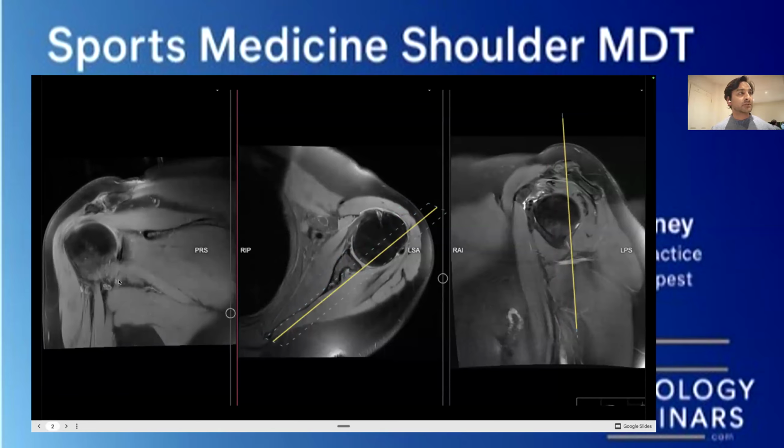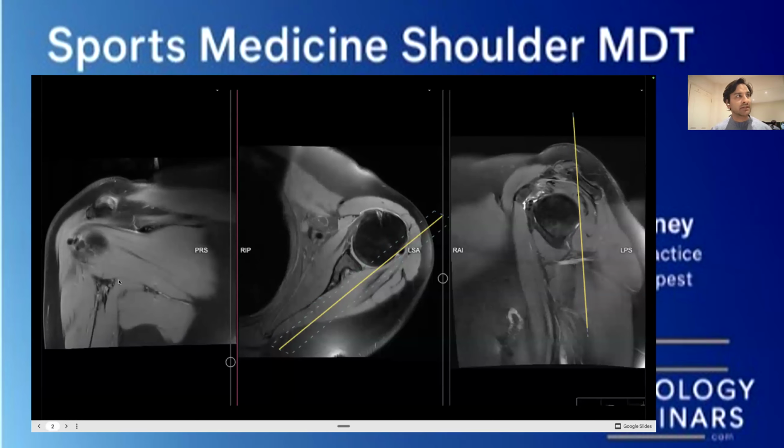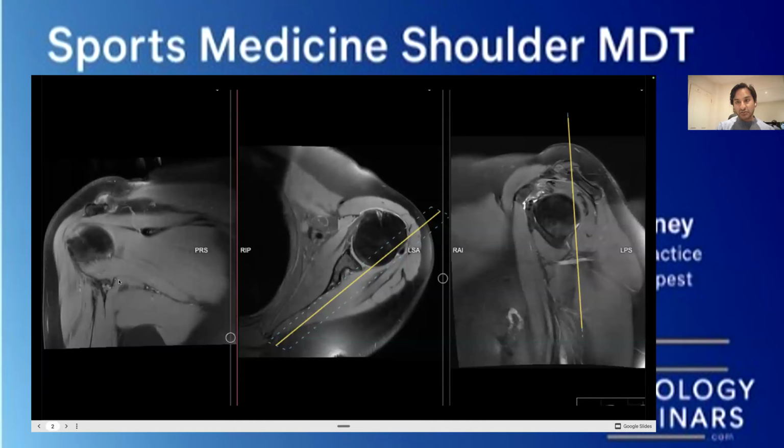So we're going to scroll through, and we've got ourselves the idea about what certain signals look like. Dark versus light, bright versus dark, all that kind of stuff right now. Now, the other thing about anatomy of the body is that things usually connect to something else. They continue into something else. Very rarely will you have something that turns up and disappears in a couple of slices. And what you'll notice here is that you've got your bone ridge that's sitting there, which must be the scapula, the suprascapular notch that's sitting over there.